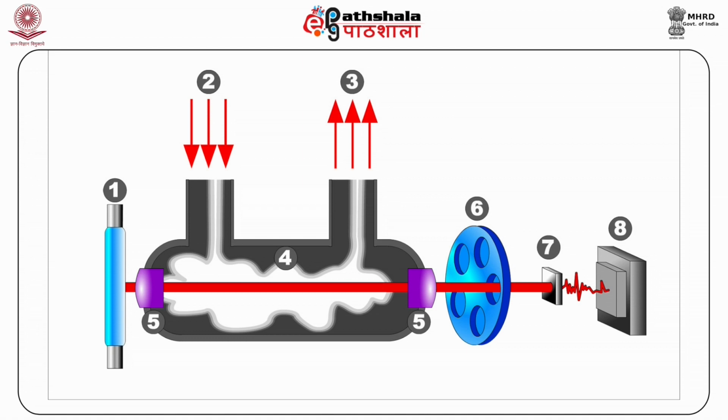The spinning filter wheel contains several narrow filters which are specific for the wavelengths of those bonds that are present in ethanol. A photocell detects the light crossing each filter and converts it to an electrical pulse. This electrical pulse is then directed towards a microprocessor, which interprets this pulse for calculating the BAC on the basis of IR absorption.